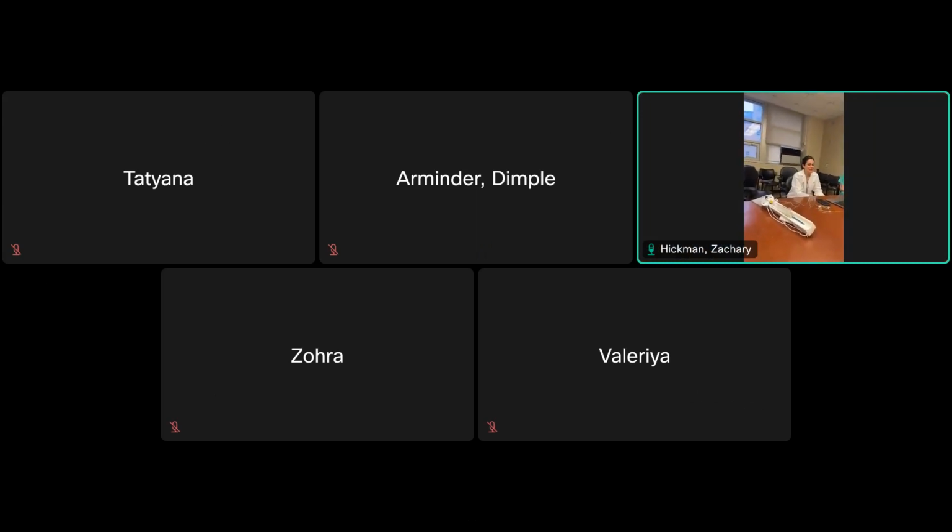So we're going to be discussing today again the EVD placement indication, troubleshooting the EVD, zeroing the EVD. Maybe we're going to start by saying the two main functions of an EVD. That would be drainage of CSF and then monitoring of ICP. And what would be the main reasons or causes where you want to drain the CSF from a patient?